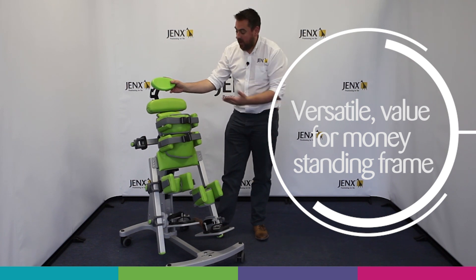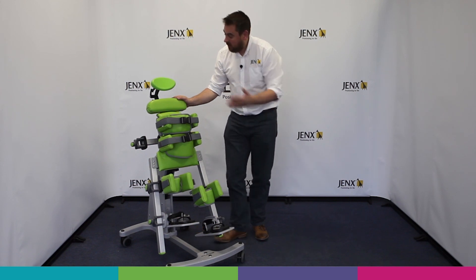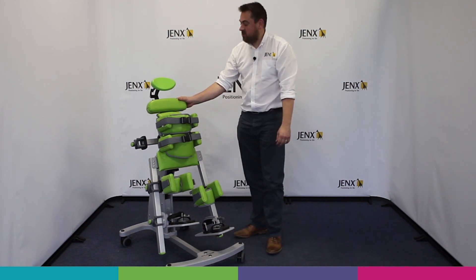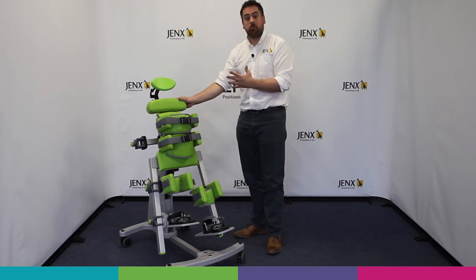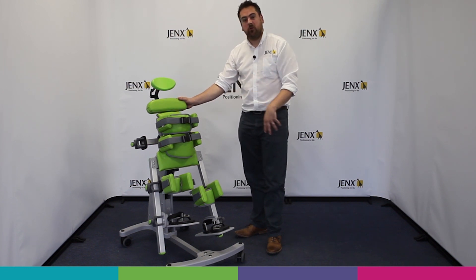This makes Stands an ideal product when you're looking at a standing frame which gives real value for money and the versatility to accommodate the needs of growing and changing children. At the moment we've got Stands set in the supine configuration, which is probably the most popular application for the product, particularly for those children who have poor head control.